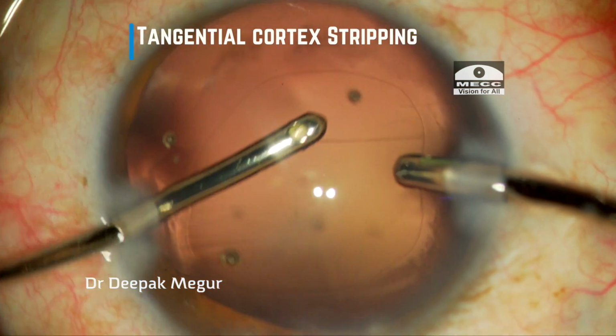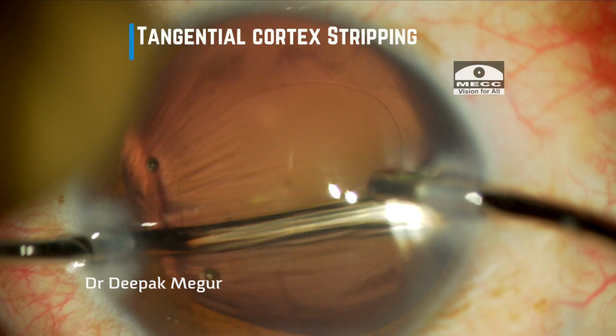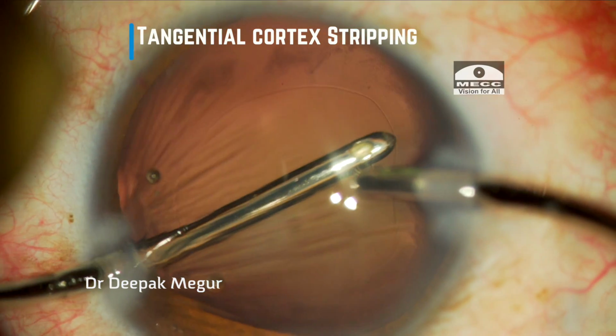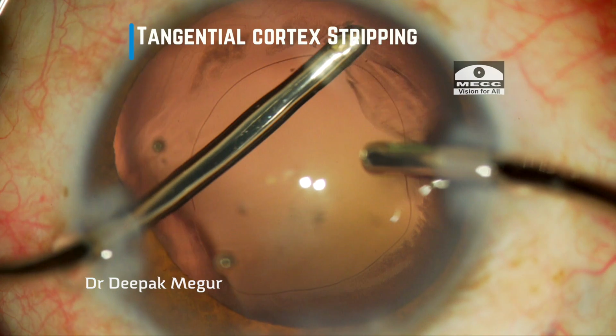Instead of the traditional technique of stripping the cortex in a radial motion, we can use a tangential motion, which helps in negotiating the entrapped cortex better. The tangential stripping of the cortex is also very beneficial in cortex removal in all eyes with zonular weakness.